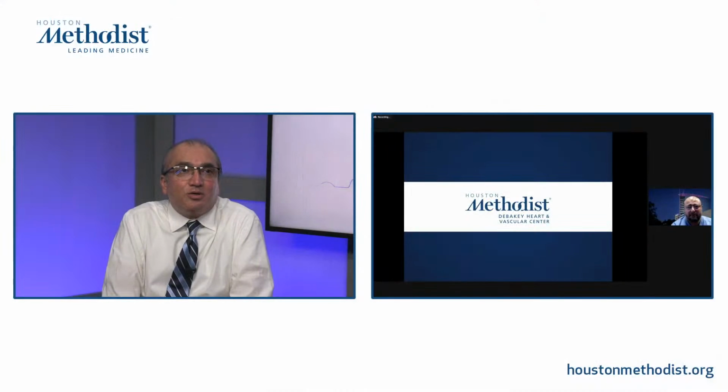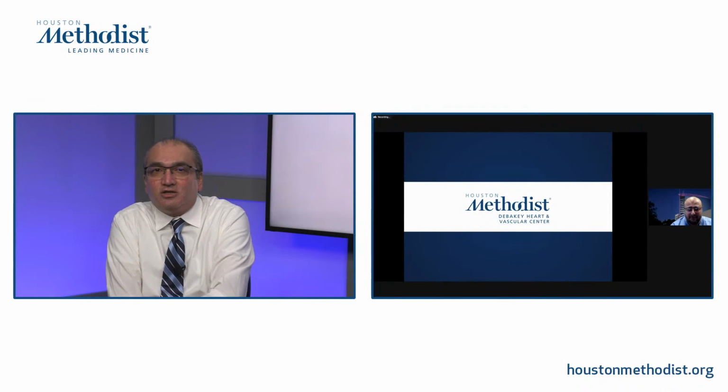And maybe let me ask you another question, and I think you touched on this before. One of the pitfalls or limitations with PYP is a recent MI. I think most of our fellows are probably not aware of it. This goes back many years when people were doing PYP scans specifically for that reason. I guess the question would be, what do you define as recent MI? And the second thing is, I think that's an important thing to bring up, because we've had cases where a person who has a background of an infiltrative cardiomyopathy comes in with acute coronary syndrome, and that can then cause confounding to your PYP results. I thought it'd be a good chance to touch on this a little bit more.